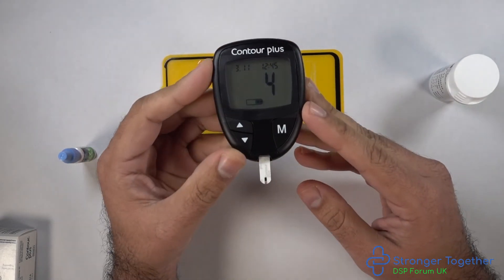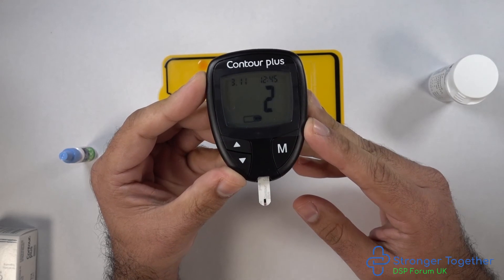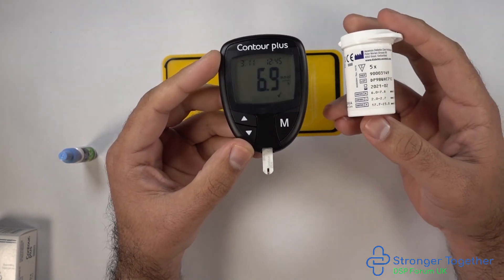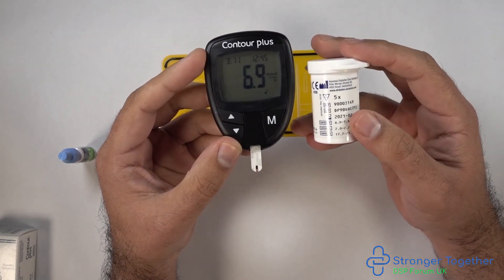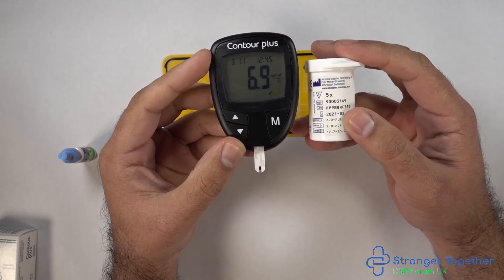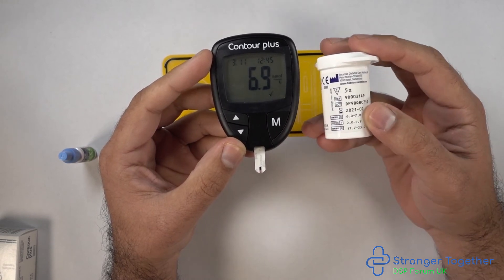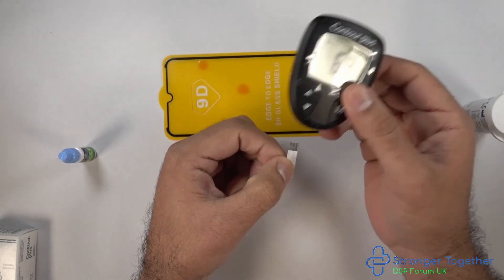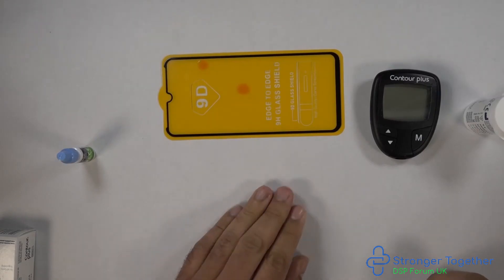Once we have done this there's a countdown from five to one. Our reading is 6.9 millimoles per litre. If we look at the side of our pot, this reading is between 6 and 7.8 millimoles per litre, meaning our meter and strips are working correctly. We then discard our test strip. We are done.